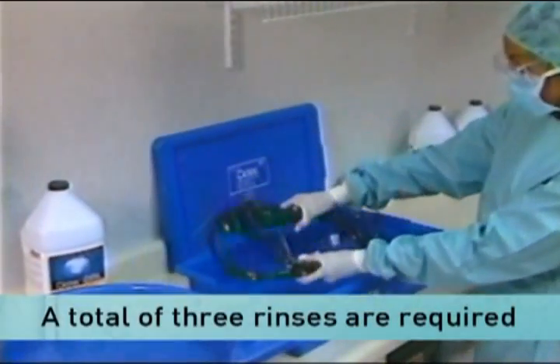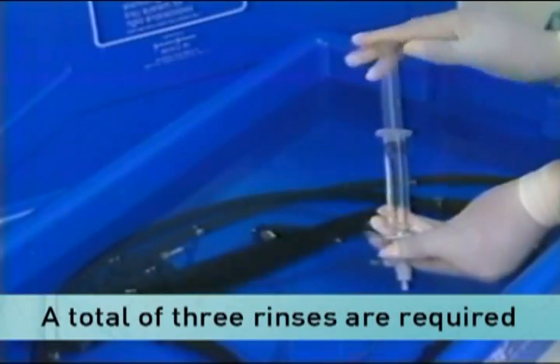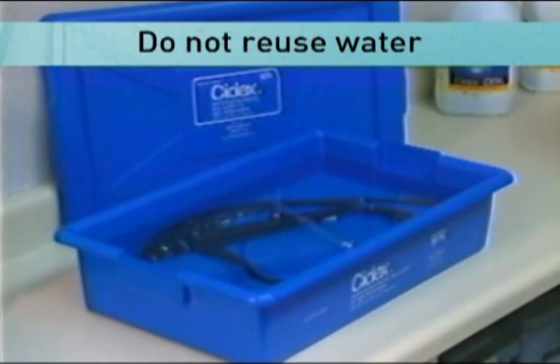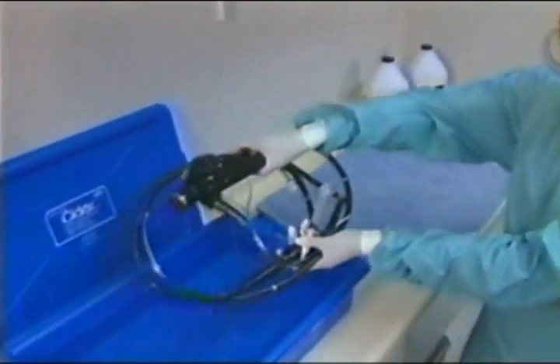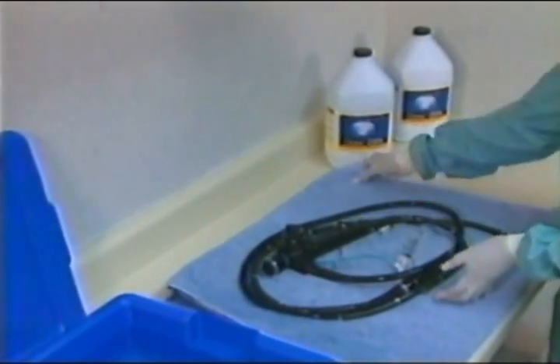Following disinfection, rinse instruments thoroughly, flushing the channels with potable or sterile water three times. Each rinse should be a minimum of one minute in duration, and it's recommended that a volume of fresh water be used for each rinse. Now it's time to dry the instruments. Once dry, the instruments are again ready for use.